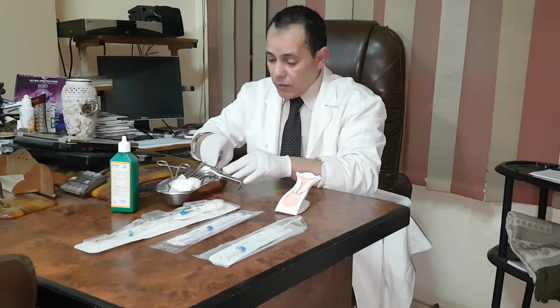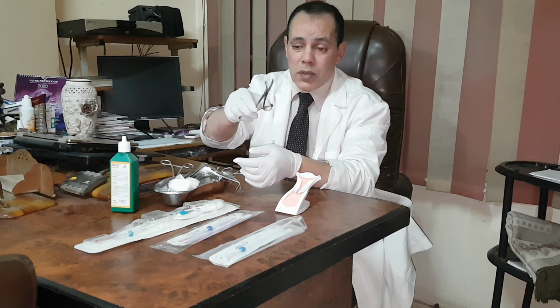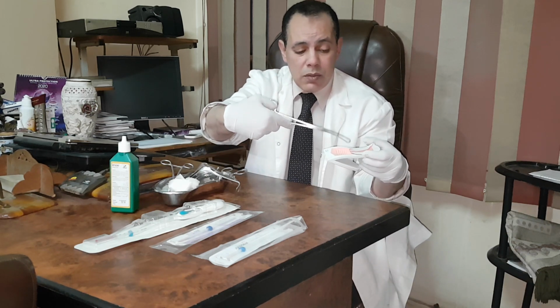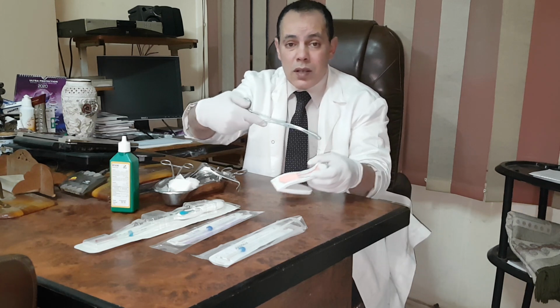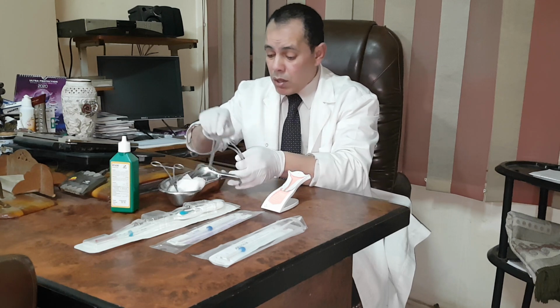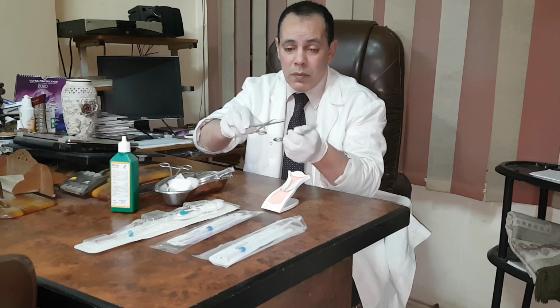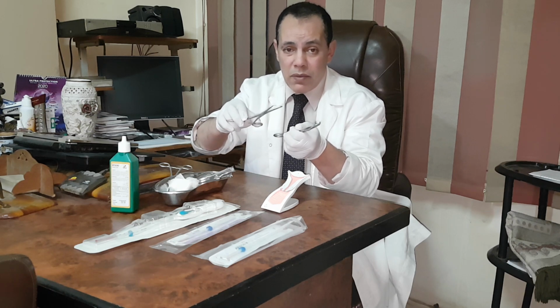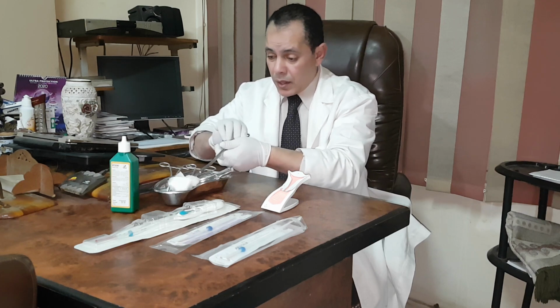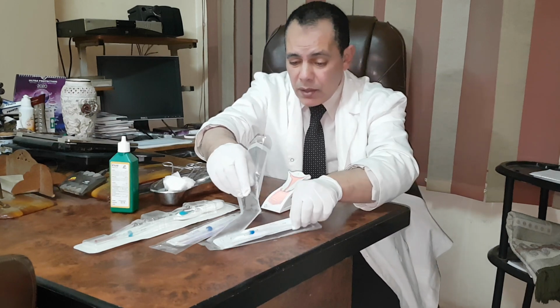What is needed also? Volsellum, multiple-toothed volsellum to fix the anterior lip of the cervix, to hold it like that. So I need the multi-toothed volsellum, or I need the single-toothed volsellum. Either one of them is used to hold the anterior lip of the cervix before insertion of the IUD. Okay, let us try to see the different types of IUD.